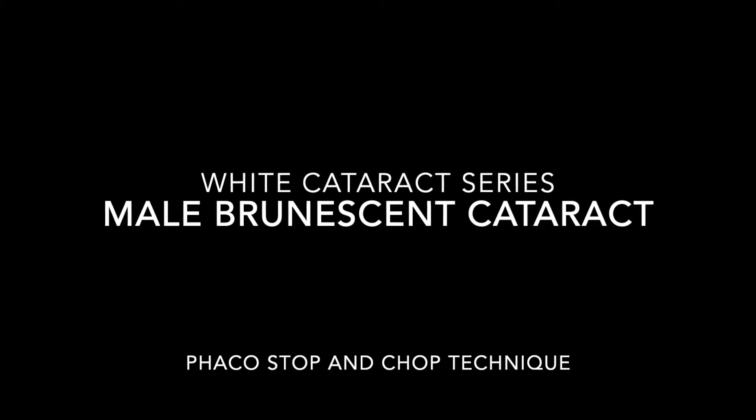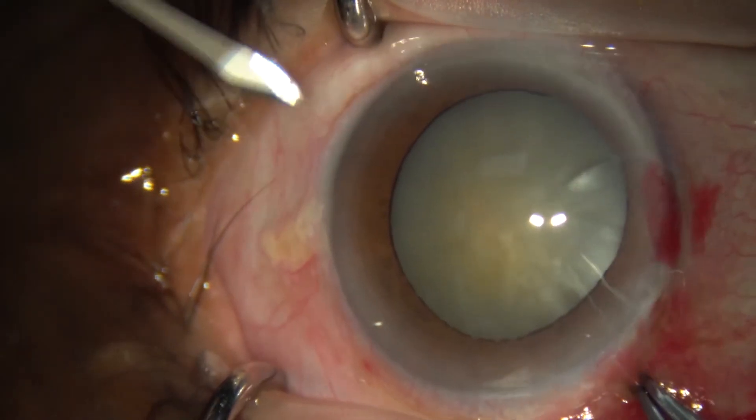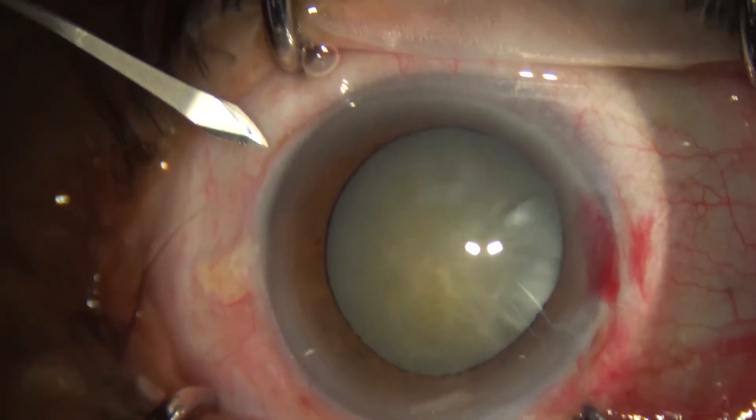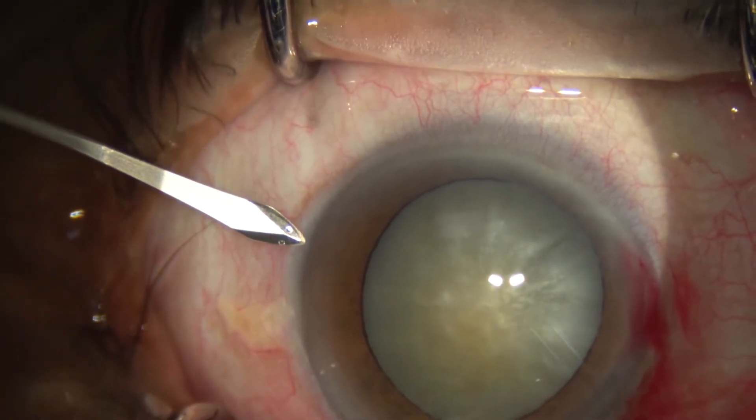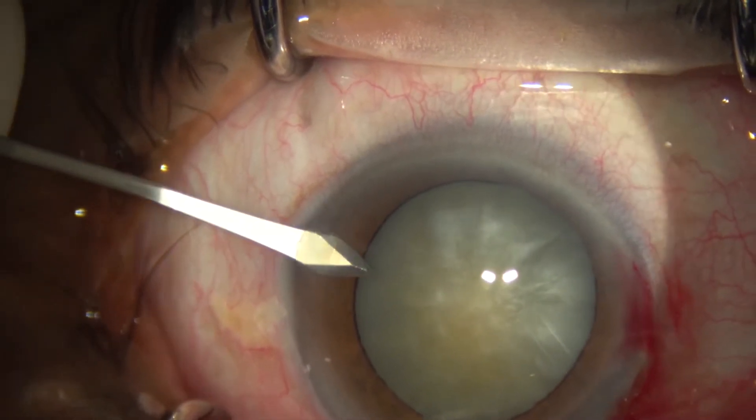Welcome to the ODOX iCare white cataract series with the male brunescent cataract, where we share different techniques of cataract surgery. Today we're going to be showing you the phaco stop and chop technique.